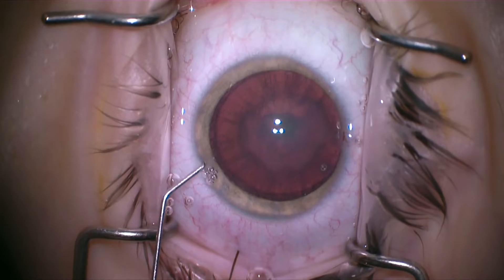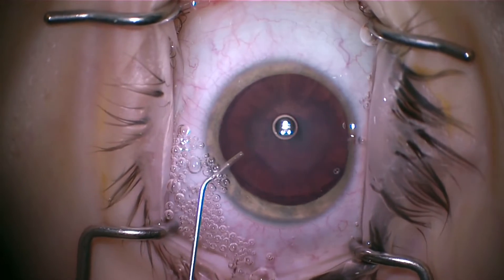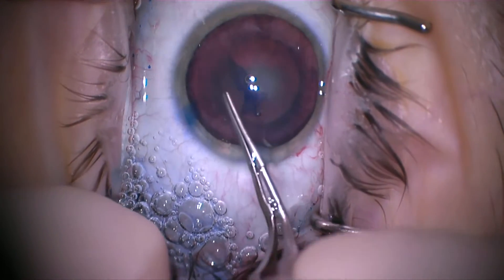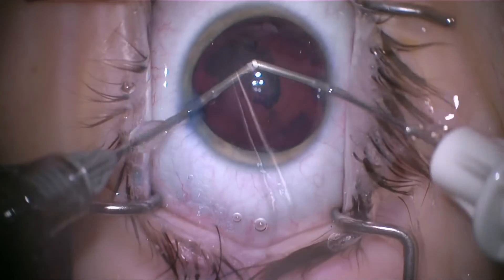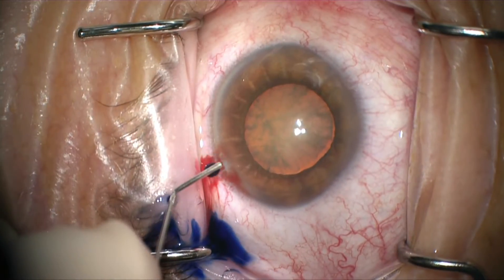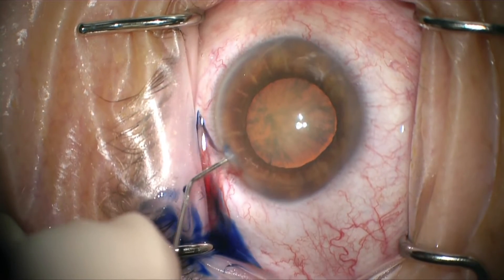Even more fancy: you can put air in the cannula with the Tri-Pan Blue, so you get an air bubble and Tri-Pan Blue all at once. It's really slick — it's one less thing to do — and you still get great contrast. In this case we're doing a pediatric cataract with a posterior polar. But every once in a while you can run into a problem, and that happened to us the other day.